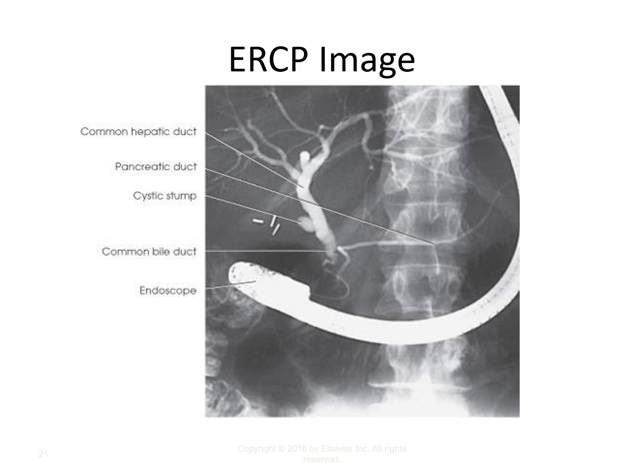Okay? So I've seen that during an ERCP, and I've also seen a stent placed to keep the ampulla opened and allow for free drainage, and that was in extreme cases.